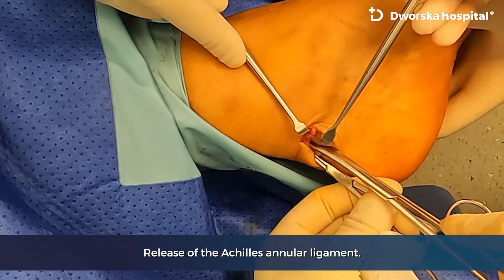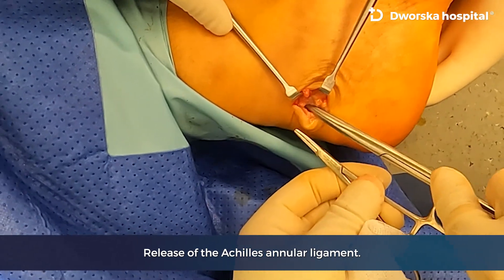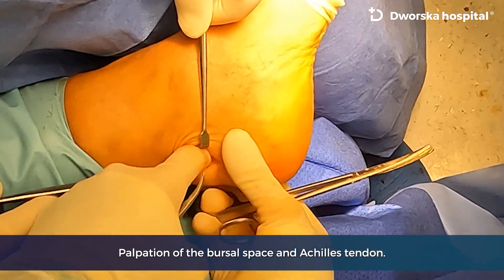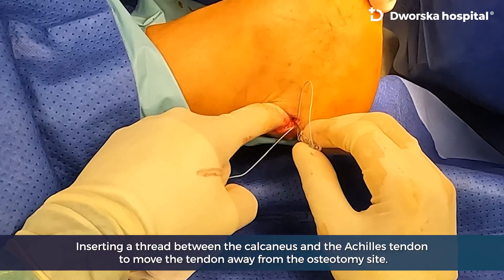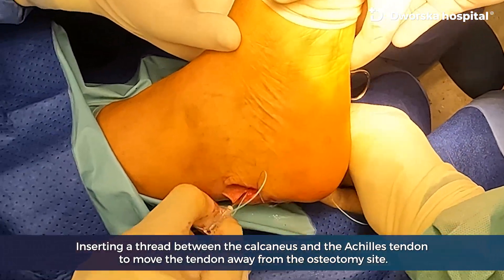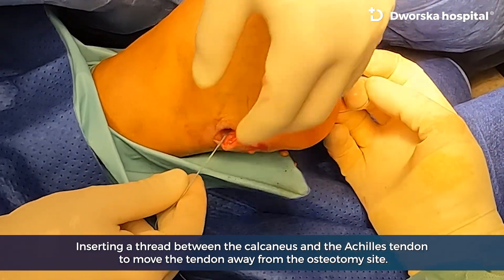Release of the Achilles annular ligament. Palpation of the bursal space and Achilles tendon. Inserting a thread between the calcaneus and the Achilles tendon to move the tendon away from the osteotomy site.